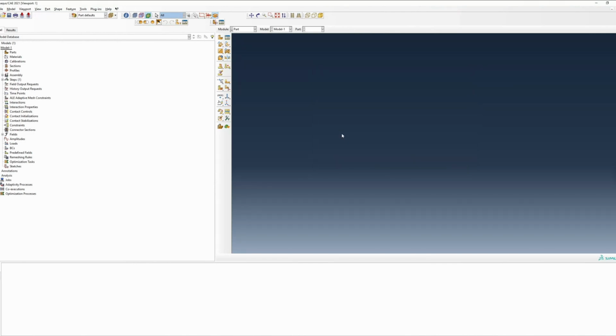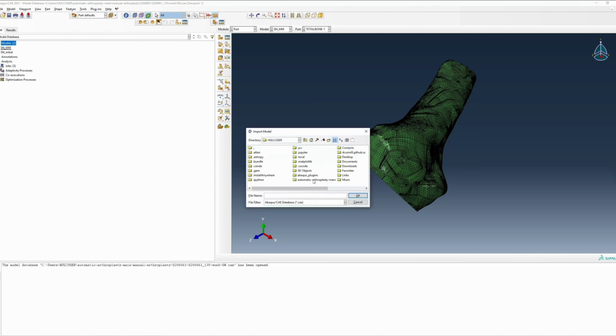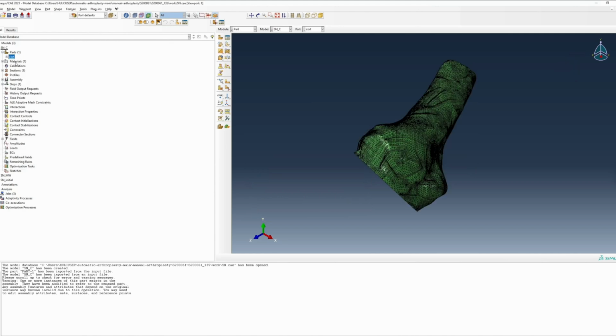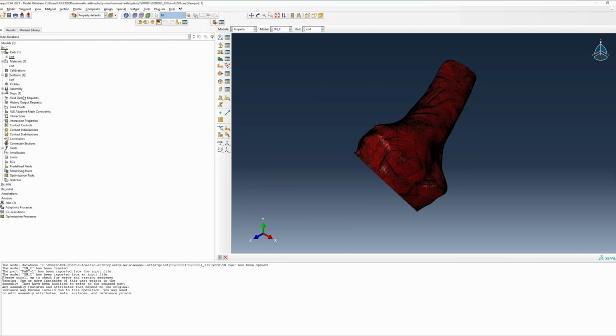To get started setting up our analysis, import your recently exported material applied model files into Abaqus. This can be done by right-clicking on the models portion of your models tree. Please ensure that after importing your cortical homogeneous bone model that you rename the part, the section, as well as the material. If you neglect to do so, then your cortical will be overwritten by your material, your part, and your sections for your trabecular bone upon import.